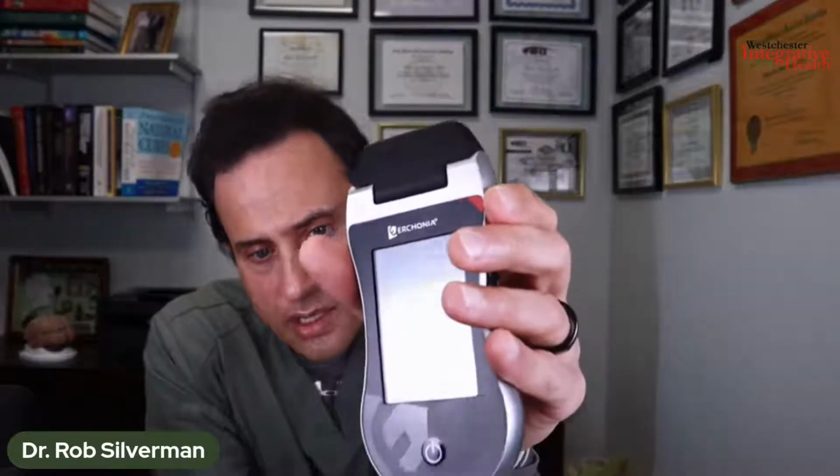The nonlinear is more random. Hopefully you can see it says nonlinear. A little hard to see with all the lights we have here. Nonlinear means that it's random. So 2 to 4, it could be anything. It could be 3, it could be 4, it could be 2. Not in the same number. It's random. It's all over the place, which is great. And the same thing between 14 and 28.